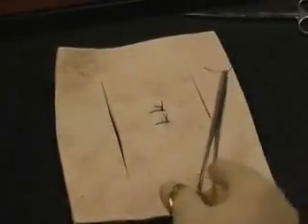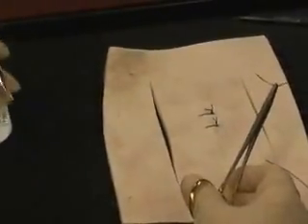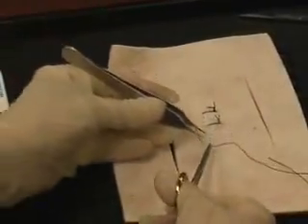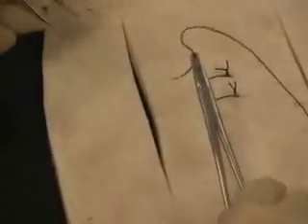Next, we're going to do a vertical mattress. Vertical mattress is excellent for deeper wounds. It's a wound that you want to close not only superficial but deep. So we're sort of simulating this is a really deep wound. Another name for this one is the far, far, near, near. And we'll go ahead and jump over and do this laceration here.